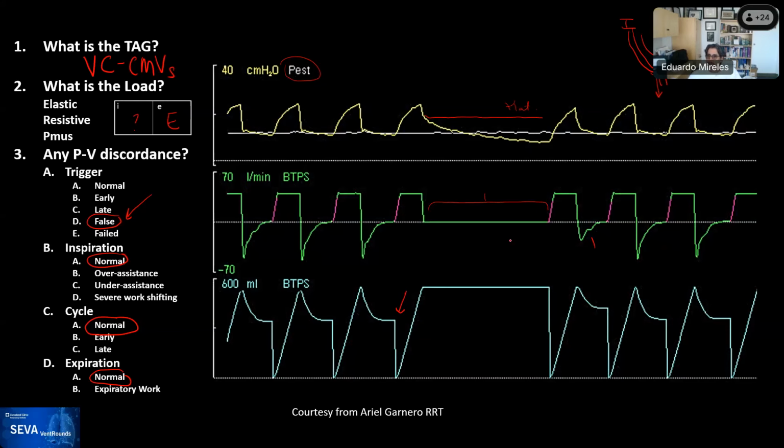I don't see other questions. So yes, Mike, the large leak caused the false trigger. So how would you solve this? You have a couple of options here to solve the issue.